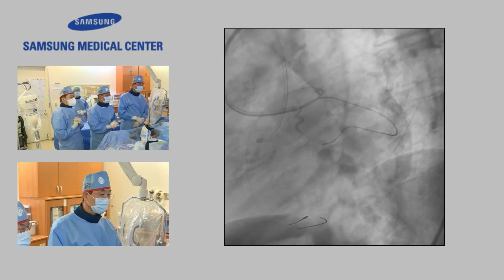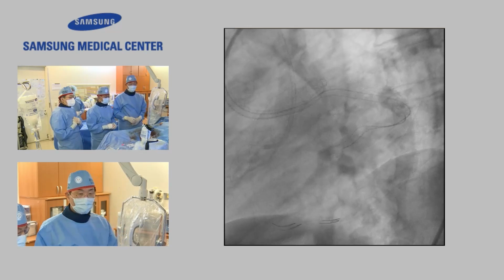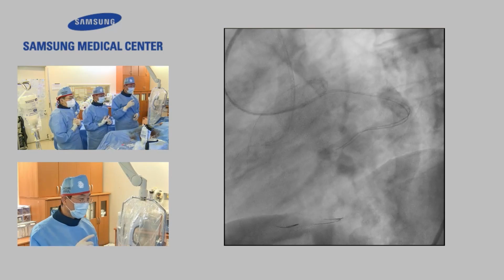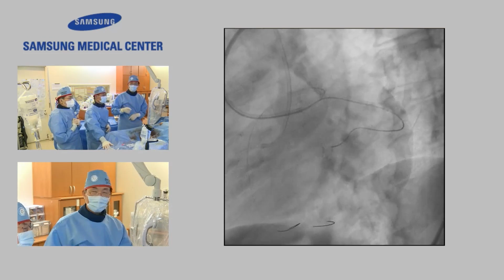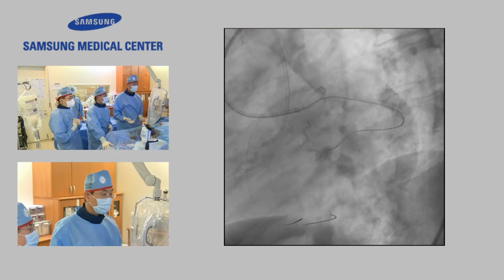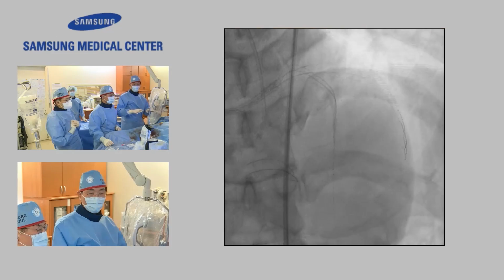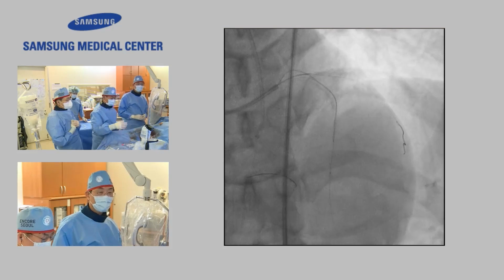So how about the anterograde tip injection from the Corsair? Unfortunately, we already removed the Corsair here, because you need to use a Sasuke for the diagonal approach. So if antegrade fails, we go back to the retrograde again. We try a different view and try harder. The shortening view always looks very tortuous. Actually, the lateral view is good for the initial wiring, but we need to change the view.